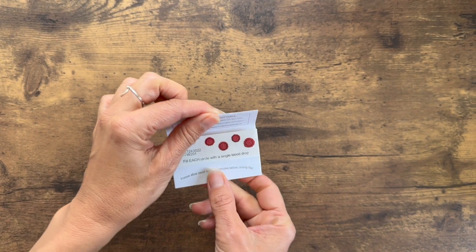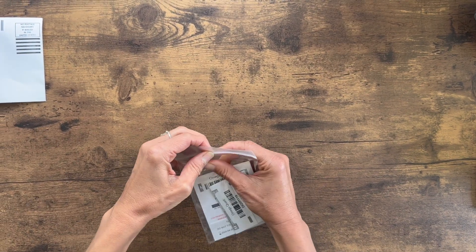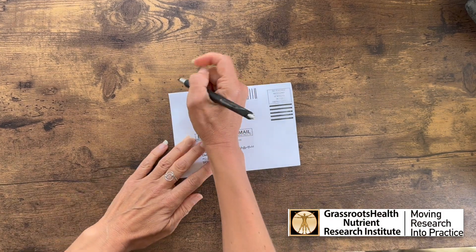Allow the blood to dry before closing them and placing them back into the Ziploc bag included in your kit. Place the cards in the return envelope with your return address and mail them right away.